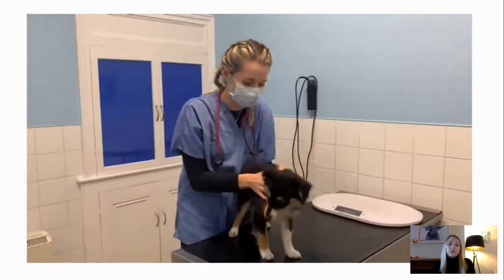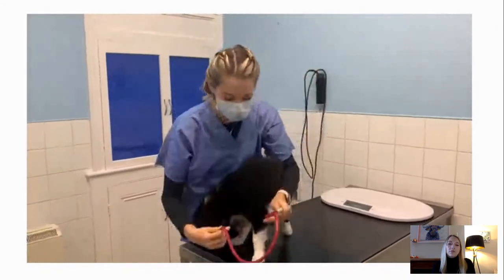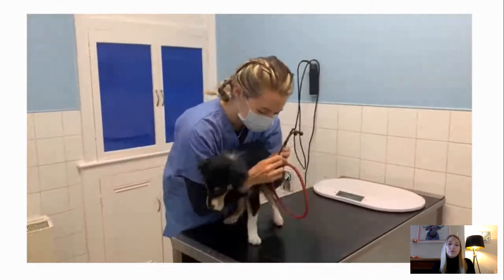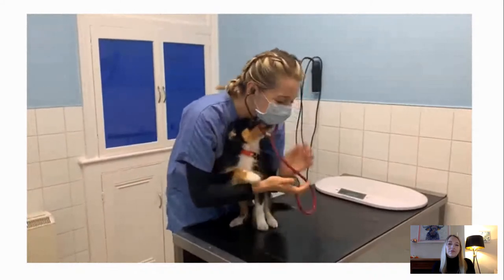Good girl. Okay, so the next thing I'd usually do is have a listen to the lungs and the heart. Good girl, good girl.